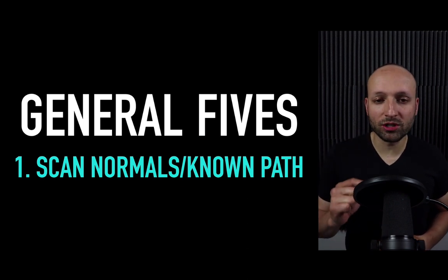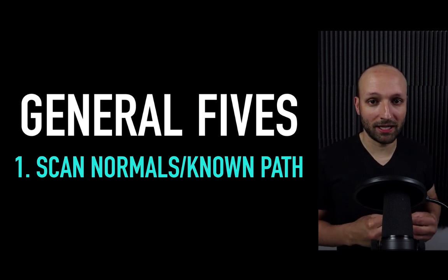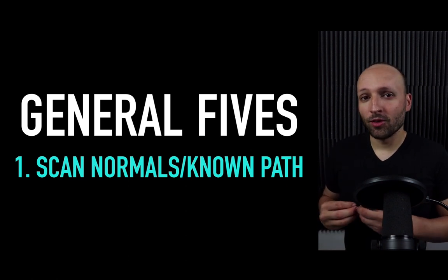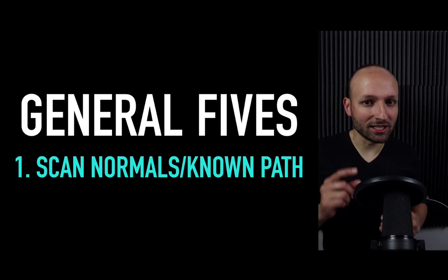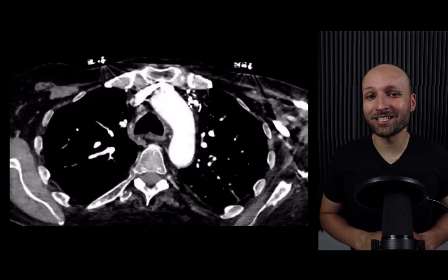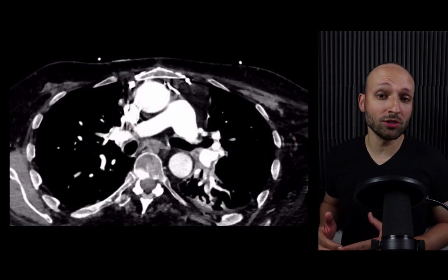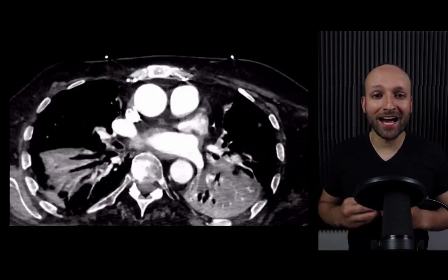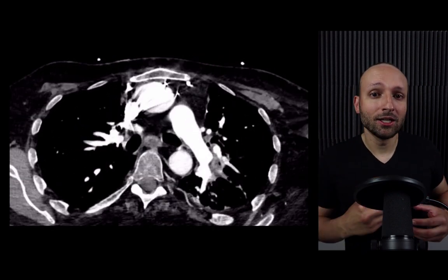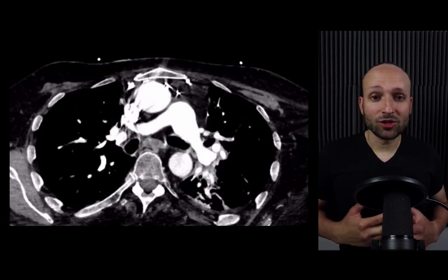Now, probably the most important tip that I can give you guys is to scan normal patients and also scan known pathology. The way to learn how to use ultrasound, especially with critical diagnoses like aortic dissections, is not necessarily to use it to primarily diagnose your patients. But what you can do is you can have a patient that has a known dissection and go back with that ultrasound and say, hey, do you mind if I take a look at your dissection? There's nothing wrong with that.